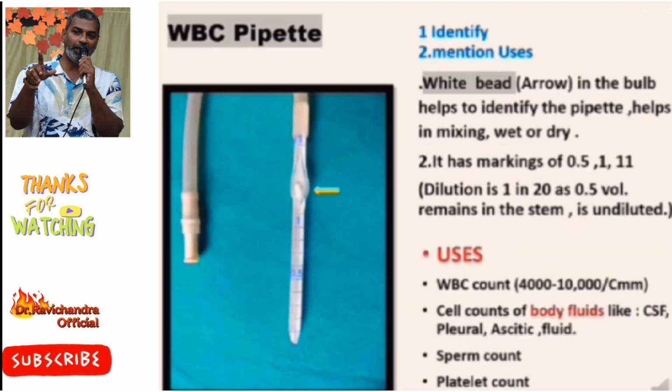WBC pipette. It has a bulb and it has markings 0.5, 1 and 11. The dilution factor will be 1 in 20 and it has a white bead in the bulb. Uses of a WBC pipette are it is used to measure the WBC count and various body fluid cell counts like CSF, pleural fluid, ascitic fluid, and it is also useful to measure the sperm count and platelet count.